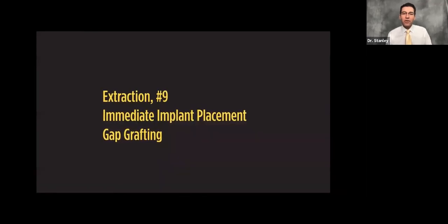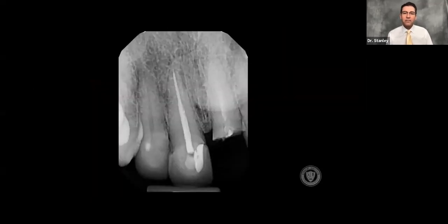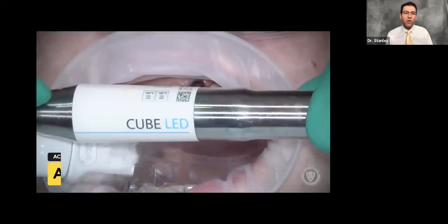Tooth number nine needs to come out. We're going to place an immediate implant and do gap grafting. As you can see, nine is broken off at the gum line. It's previously root canaled, and so is eight.